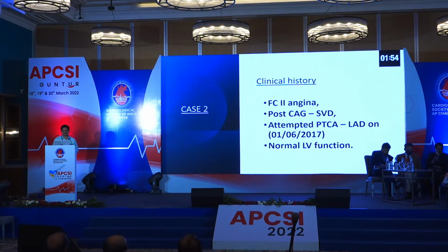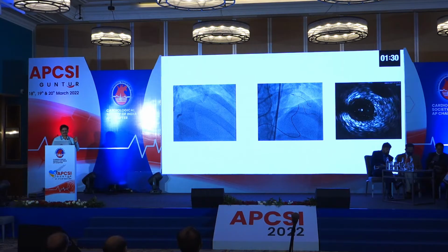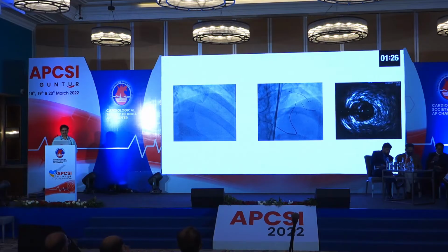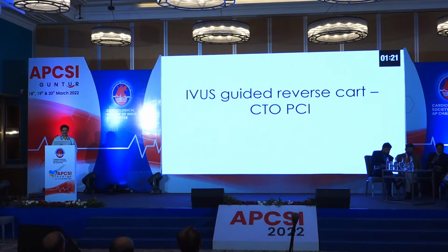And then the second case also is almost a stumpless type of occlusion. The patient with angina with a single vessel disease and attempted PCI previously failed. Then by means of a retrograde wire we keep it as a wire marker, and then with the help of real-time IVUS. For real-time IVUS, an 8 French guiding catheter you have to take and then put the wire in the side branch and keep the IVUS exactly at that one, with the Fine Cross help and the second wire penetrate the cap, and ultimately we revascularize the LAD with a good result.